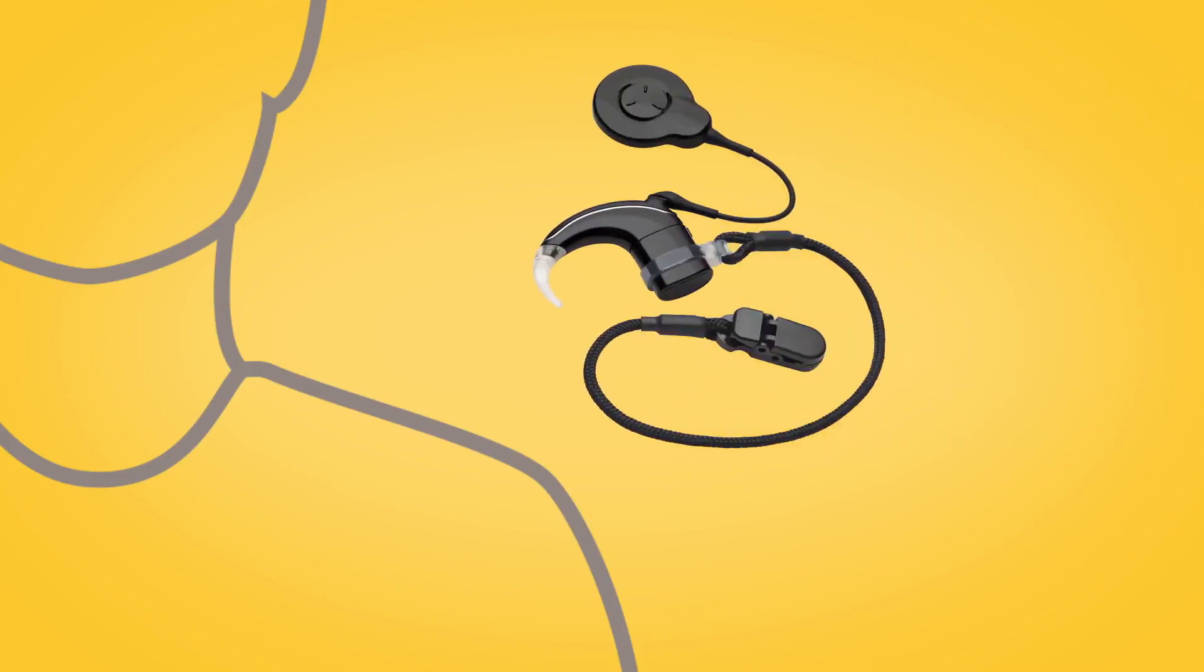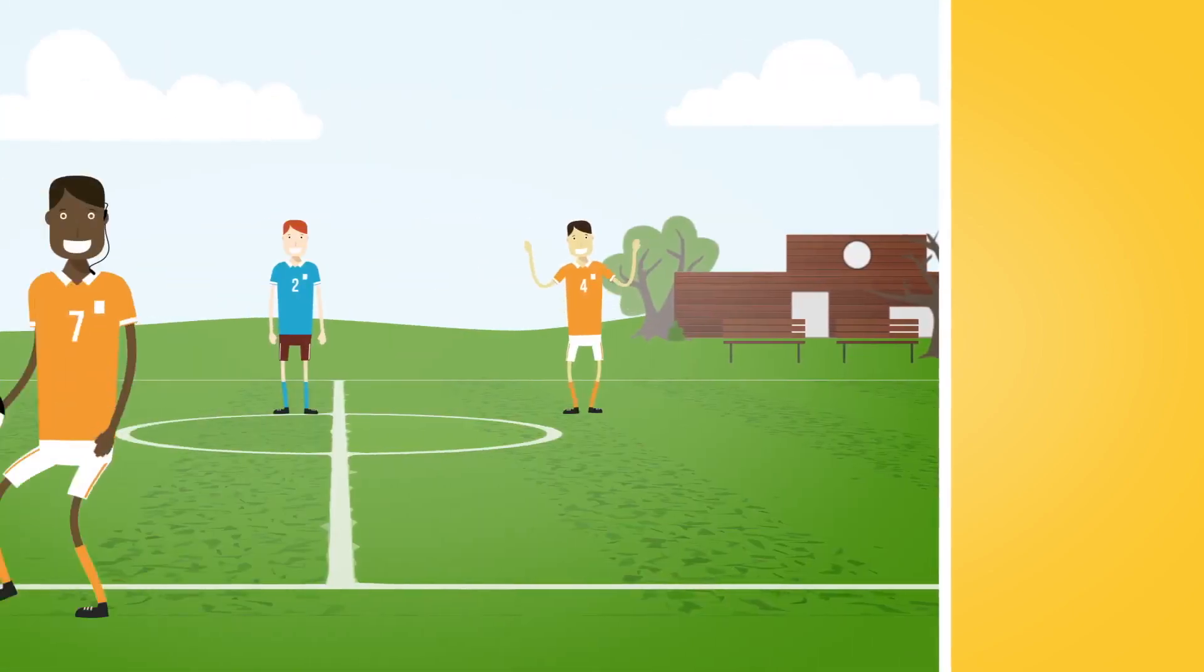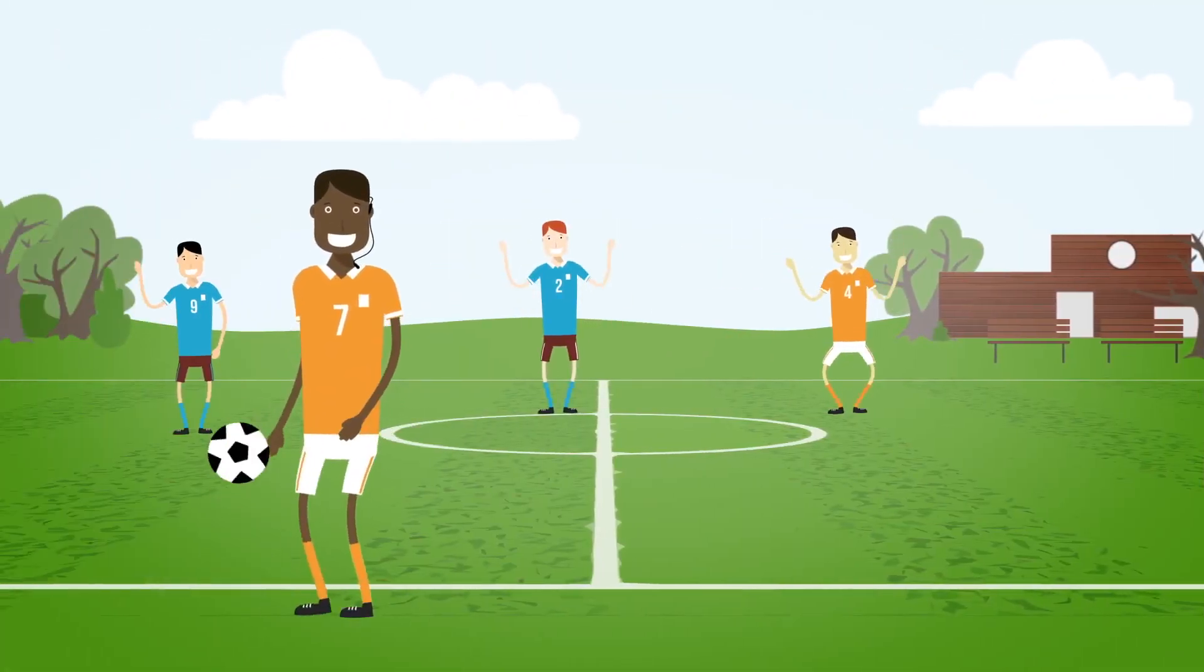Another useful loss prevention option is the Cochlear Safety Cord. This clips to clothing, meaning that wearers are less likely to lose their sound processor.